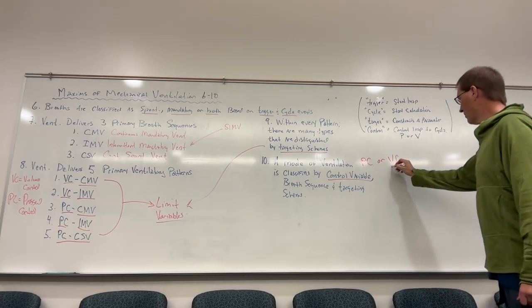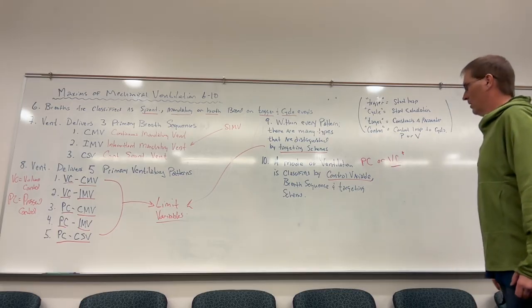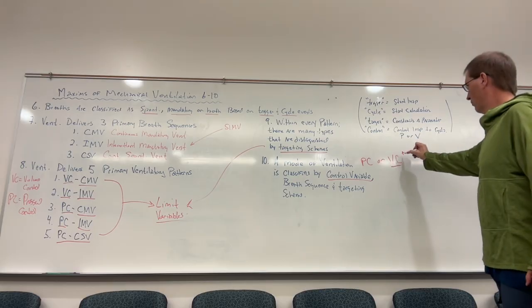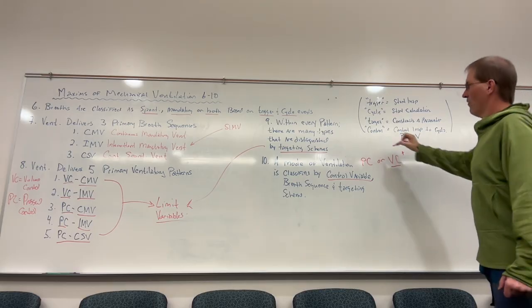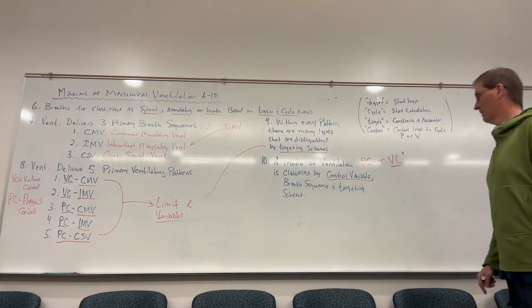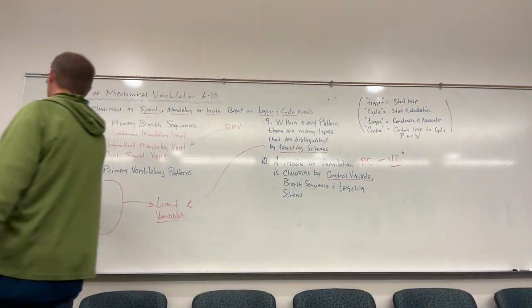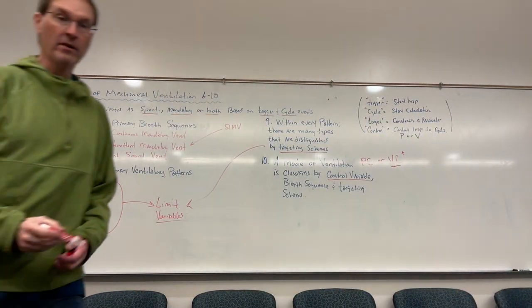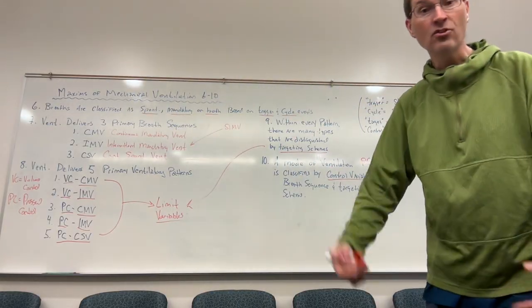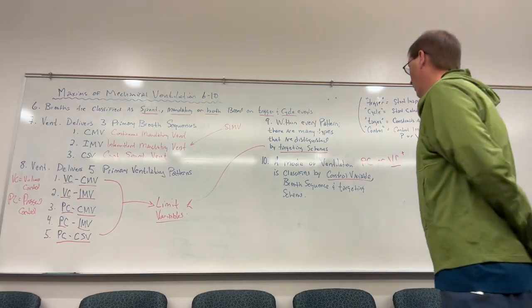And like, you can have volume control ventilation, and maybe you can have something like VC plus, where the plus is you are targeting or limiting pressure, right? And so that goes into this here, right, the limit variables. But at the end of the day, it's still volume control, and that is to say that volume is the control variable that is being used to tell the ventilator when to cycle out of inspiration and into exhalation, all right?